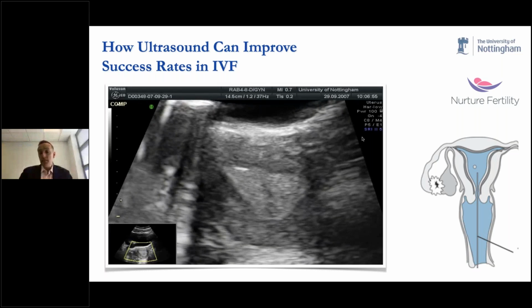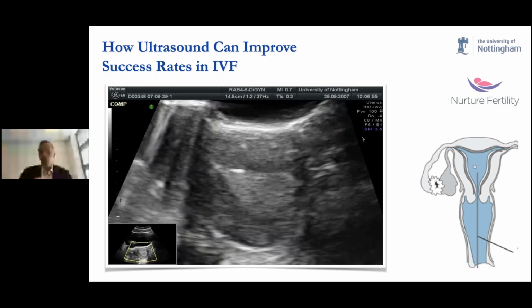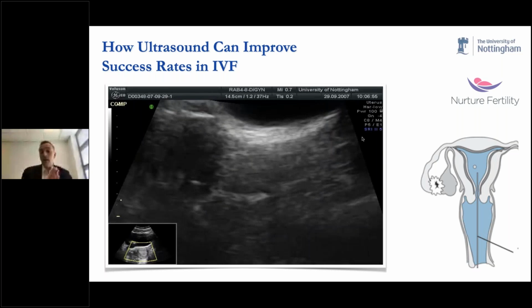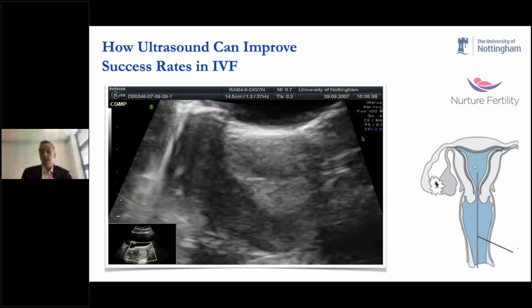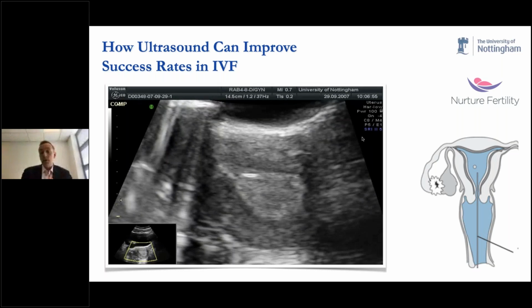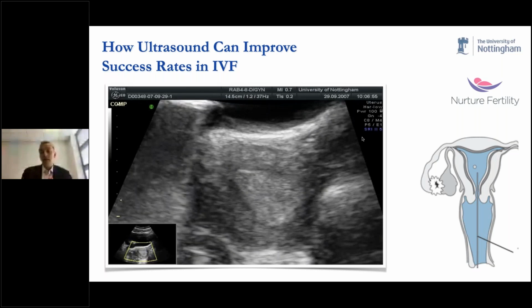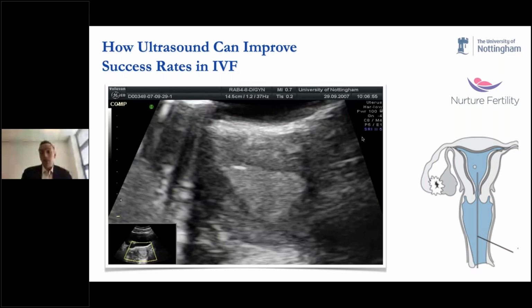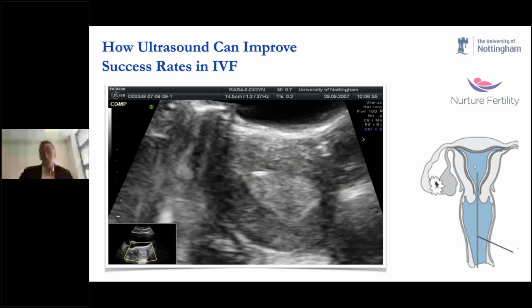No wonder some of these patients end up with ectopic pregnancy, or potentially these embryos are actually expelled while implantation doesn't occur. So we've known for a long time that endometrial contractions may have a negative effect, and there are studies looking at smooth muscle relaxants, such as atosiban and so on, to improve success of embryo transfer. But also the question is, why are we getting so many contractions? A lot of it relates to difficult embryo transfers, and that's certainly something you can reduce or improve by using ultrasound to guide your transfer, helping you get through the cervix in a simplistic way that causes the least trauma possible.